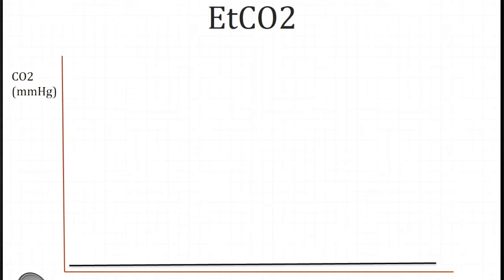Misplaced ET tubes are a cause of cardiac arrest, and this device can detect up to 23% of unrecognized missed intubations. It is a Class 1 recommendation per AHA guidelines.